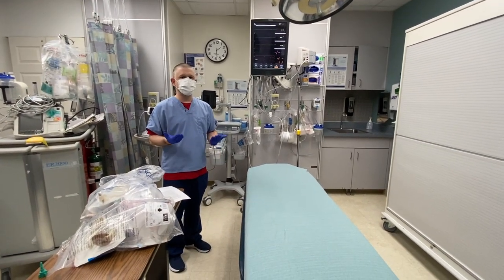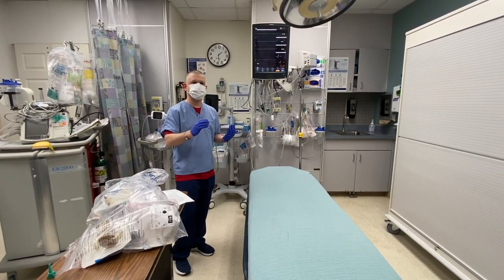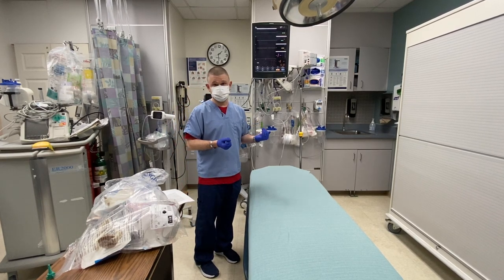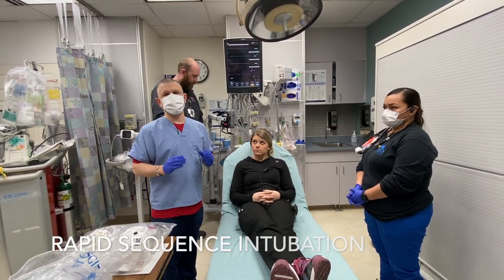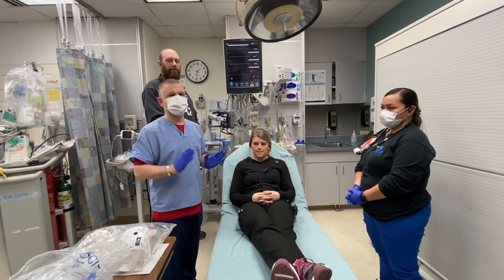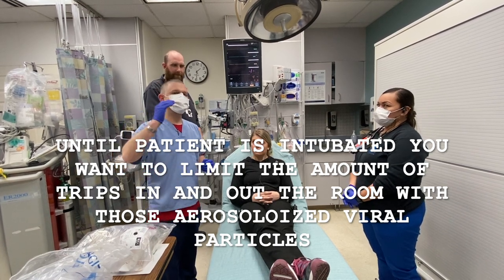I'm not going to recommend, nor have I heard the recommendation of, using colorimetric change devices for intubation, because we are actually going to be using waveform capnography. And I want to add from the last segment that the nurse will bring in your RSI kit. I think it's important to know that you have to bring in the appropriate drugs for the procedure as well. So that's another thing that you'll have to bring in from outside the room.